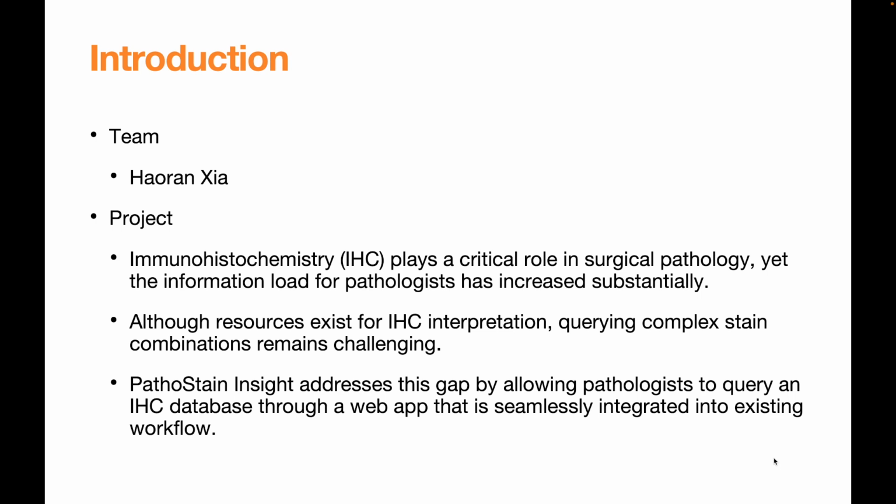IHC plays a critical role in surgical pathology, but the information load for pathologists has increased substantially in recent years. There are existing resources for IHC interpretation, but querying complex stain combinations remains challenging. This project, PathoStain Insight, aims to address this gap.